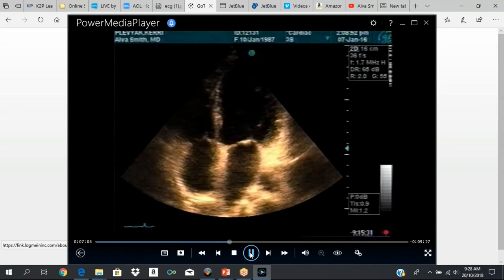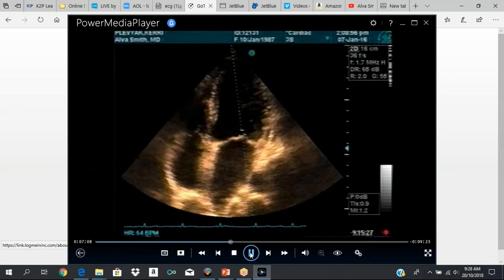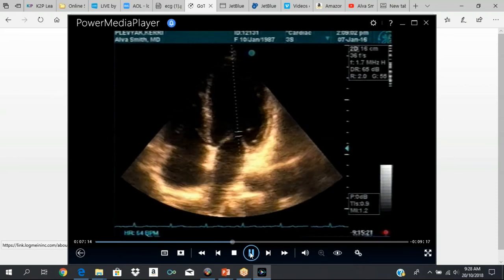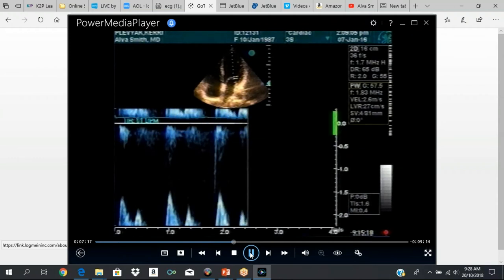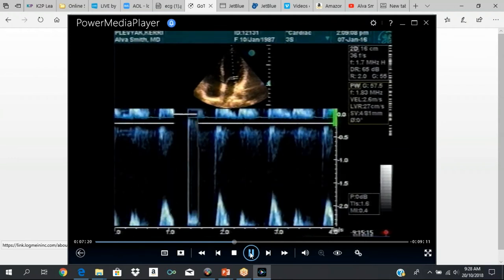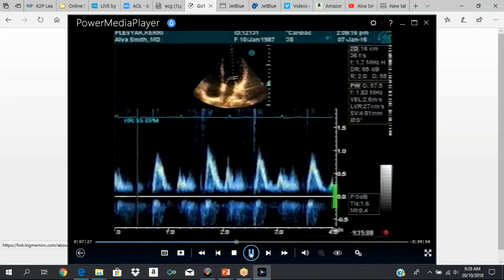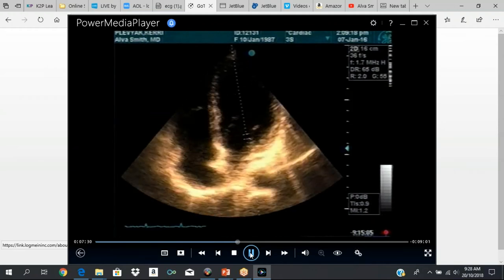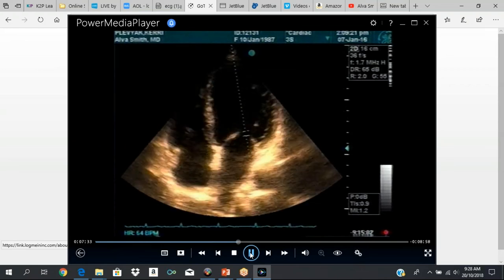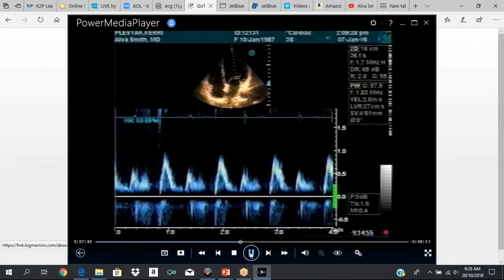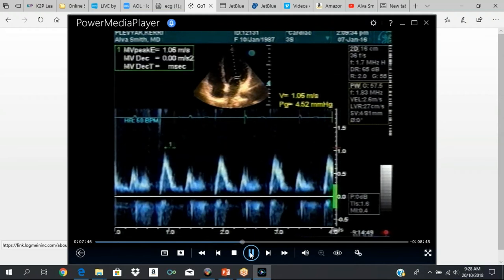In the apical four-chamber view, the heart has to be vertical. If the heart is not vertical, it's not an accurate assessment. We're going to skip the Dopplers — they're extremely important, but we're just going over the scanning views. To get the apical five-chamber view, you just tilt the angle of the transducer downwards — a very fine movement — and the five-chamber view will pop up right in front of you.